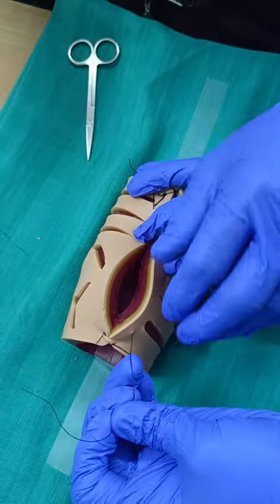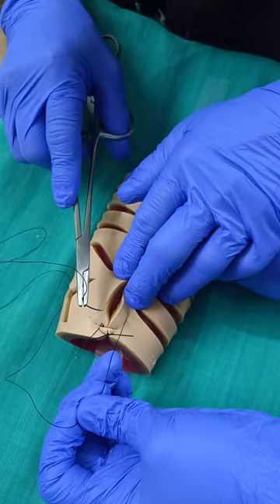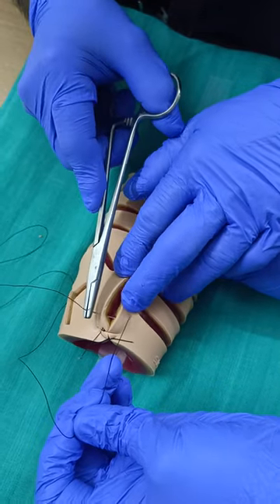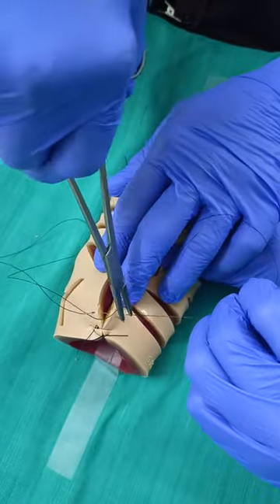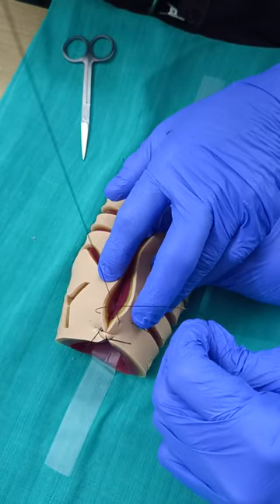Now take a superficial bite, which is serosa and subserosa, in the same direction, and take it like this. The assistant will not leave. The assistant will hold and give the traction only on this.